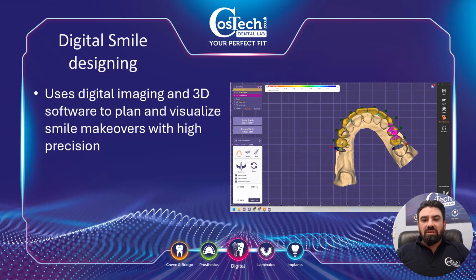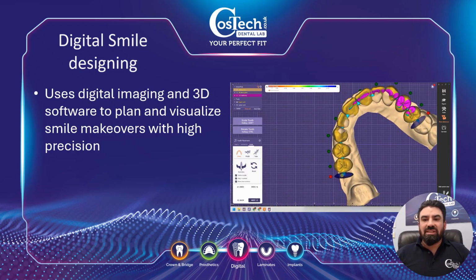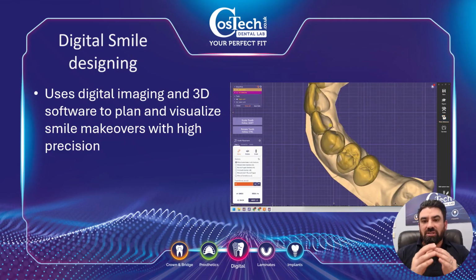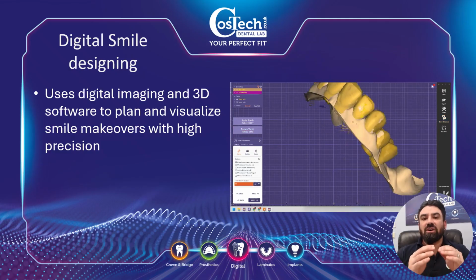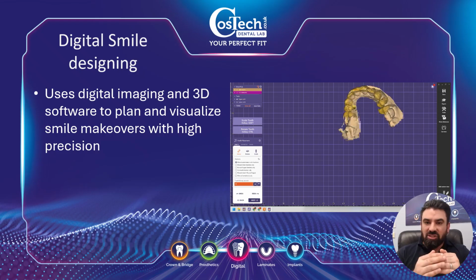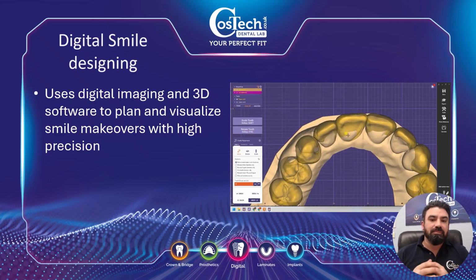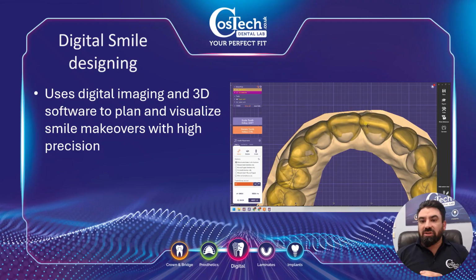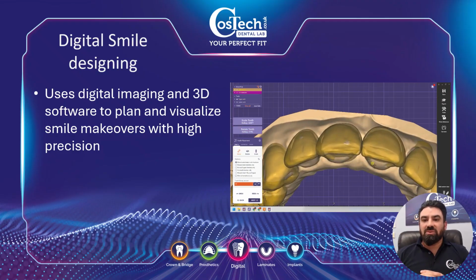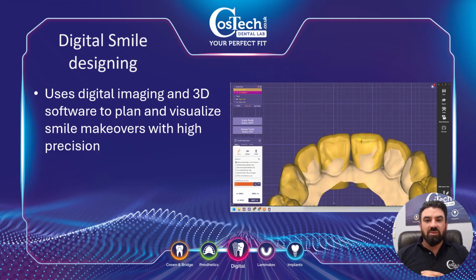So with the digital smile design, this is the sort of idea of what happens on the CAD system. We can take the perfect arch and manipulate it to fit the patient's arch as much as possible. This just gives us our first point, just to say, okay, this is an exact smile. We've got various different tooth libraries that we can call on that match the patient's existing dentition. And what we can do is say, okay, well, this is the ideal situation. This is the ideal aesthetics that the patient would possibly like.